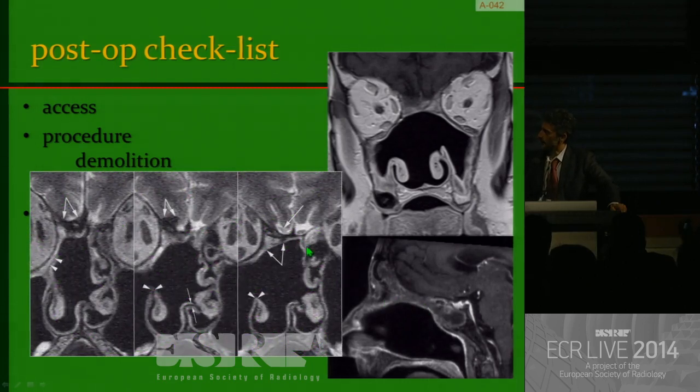Whereas in this case, the reconstruction is a bit different, because there was an intraoperative complication, a CSF leak. What you see here as a dark area is a bone periosteal flap that has been set to repair the CSF leak intraoperatively. Of course, you understand this image if the surgeon gives you the full information before scanning.